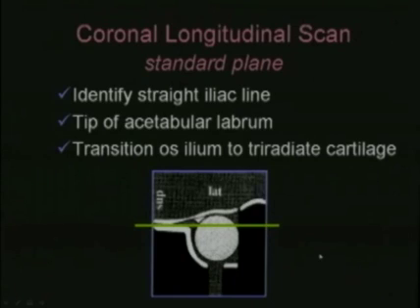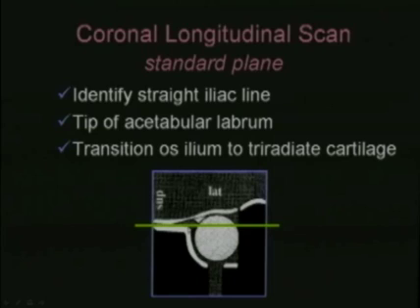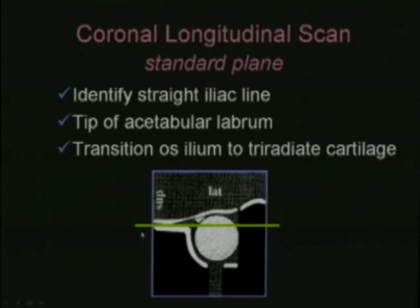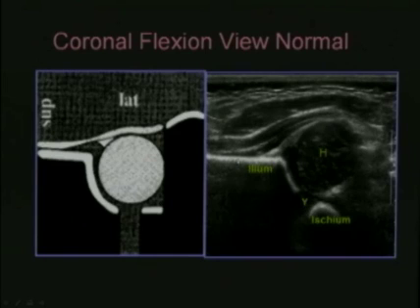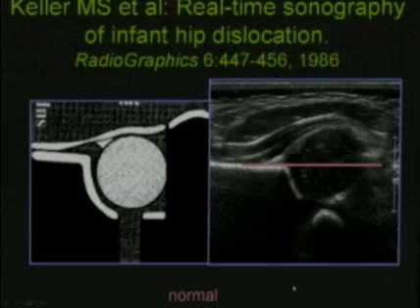The longitudinal coronal scan must be done in the standard plane. To confirm we are scanning in the right plane, we must identify the straight part of the iliac bone and draw a line parallel with the ground. We should see the tip of the acetabular labrum and the transition of the iliac bone to the triradiate cartilage. When we draw a line along the iliac bone, at least 50% of the head should be below that line — seen within the bony socket, which is within normal limits.